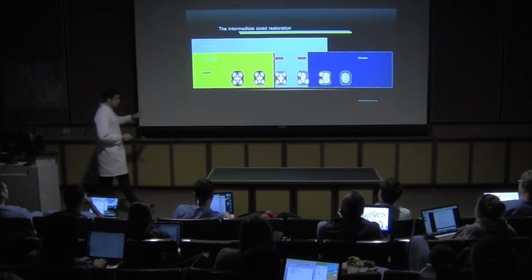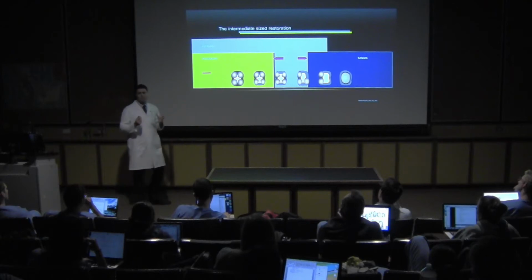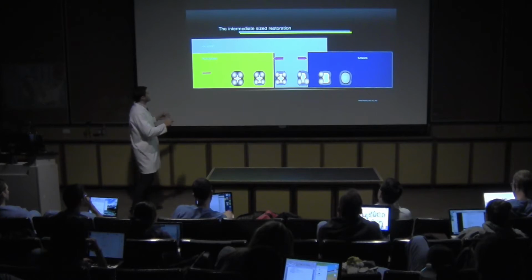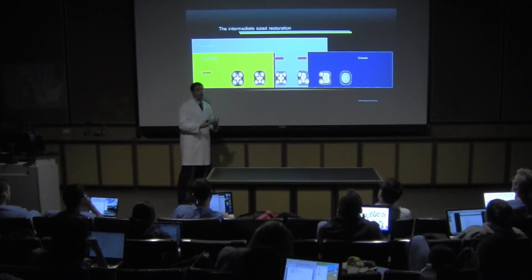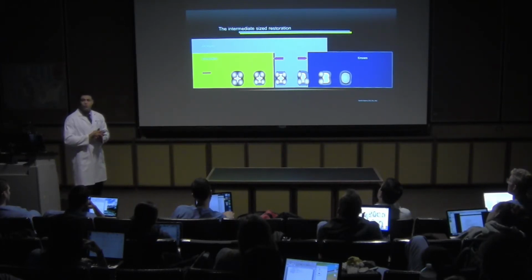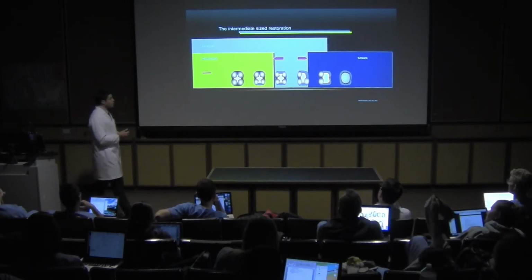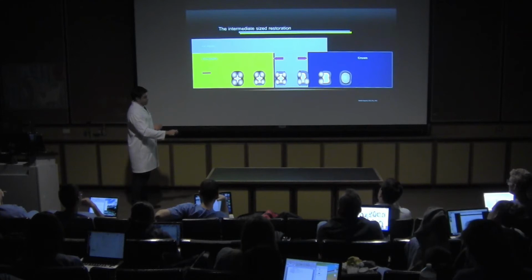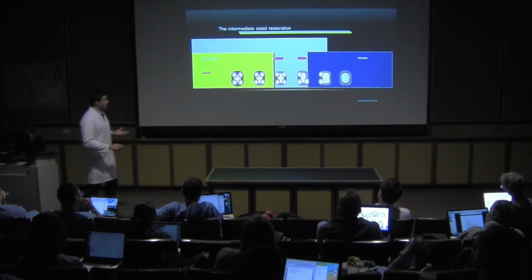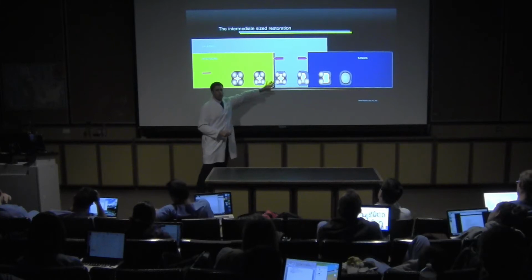So here, let's understand the two concepts. The old concept that a lot of dentists have been using to work with amalgam restorations, the composite and crowns, and now why we're going to work with the Inlay Onlay restorations. It's like an evolution of the techniques and the materials that we have in dentistry today. So here, I have a large class 2, okay, and normally we can work with amalgam here.